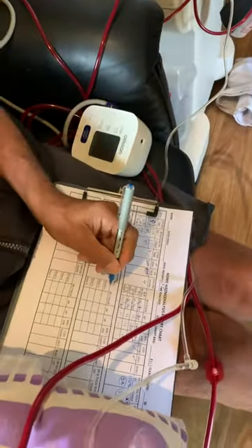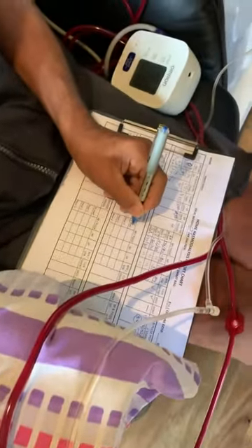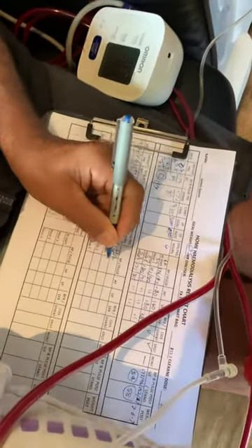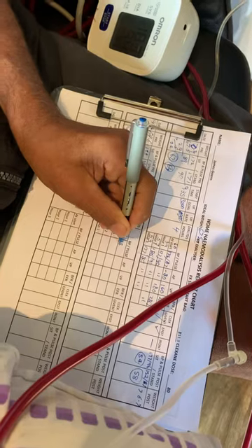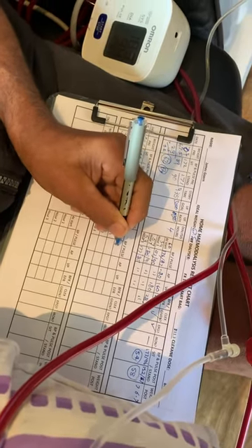He's just taking his blood pressure after he's all fully up and going. Now I have to do it left hand, my opposite hand. It takes me a while, but I'm getting used to it.